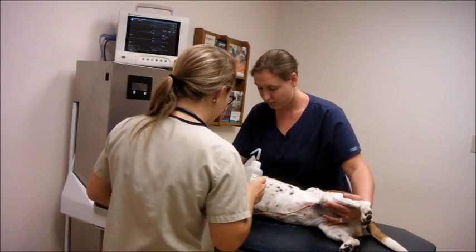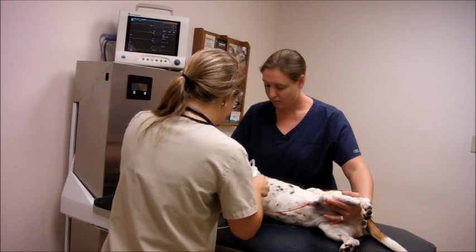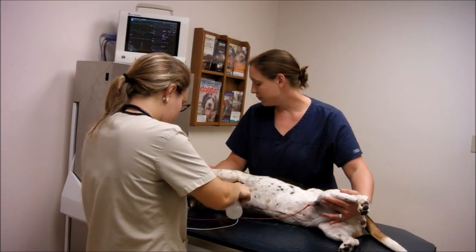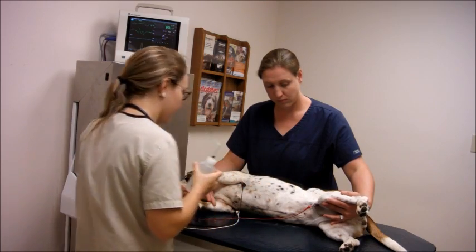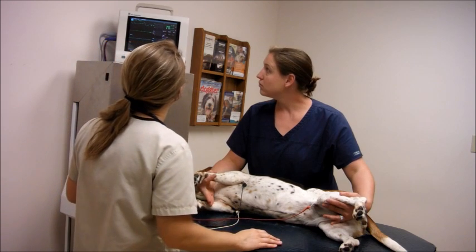I'm going to use alcohol and apply it to the leads. They're already starting to pick up a little bit, but applying the alcohol will help tighten the contact to the body so that the electrical impulses can really get picked up well. Alcohol is now applied.